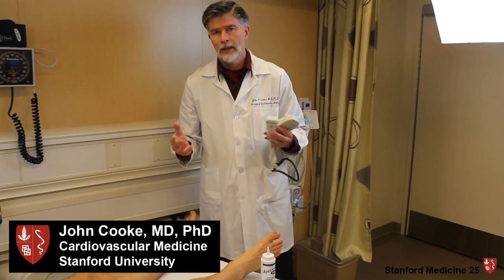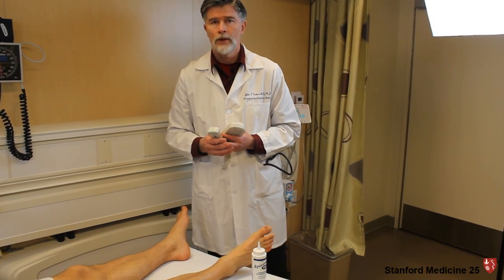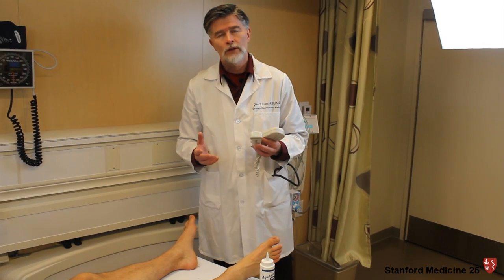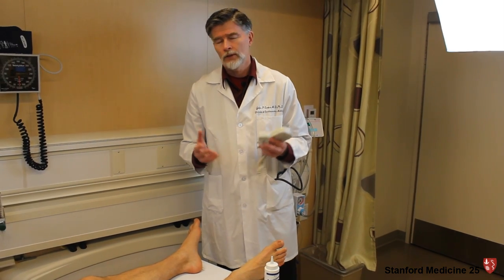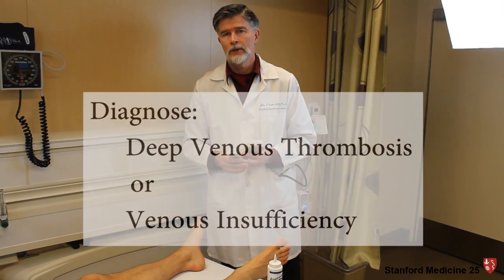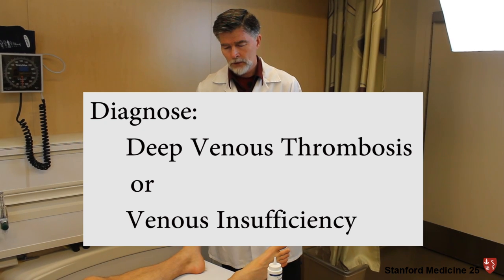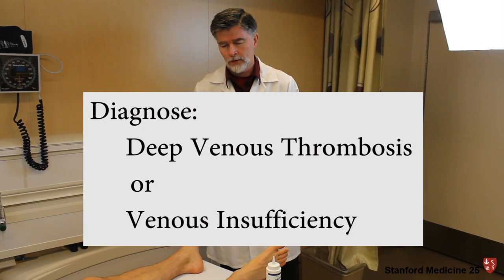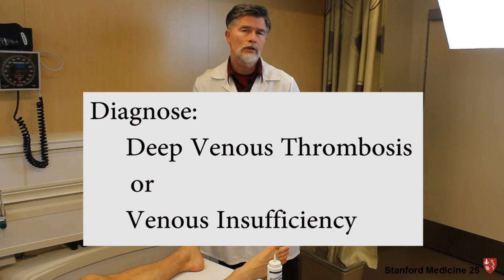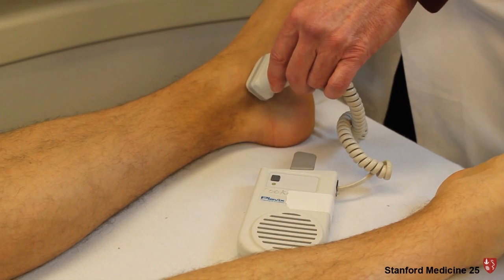Individuals may come to the office frequently with swelling in their lower extremities, and one of the things you have to think about is: does this person have deep venous thrombosis? Does this person have venous insufficiency? There are some things that you can do at the bedside with a handheld Doppler.